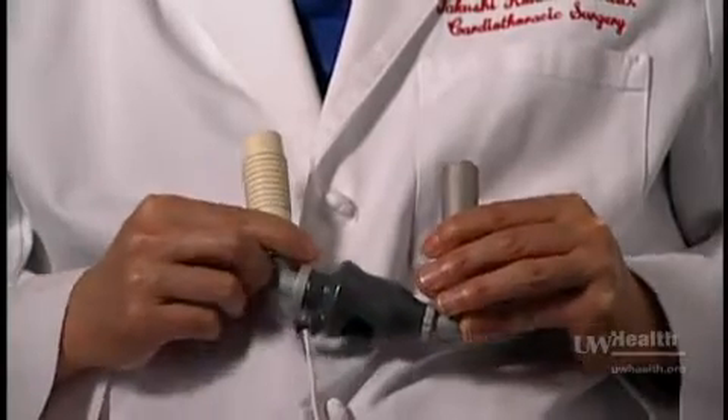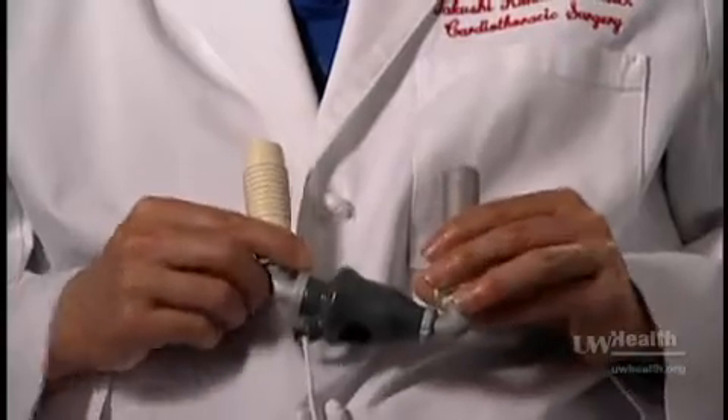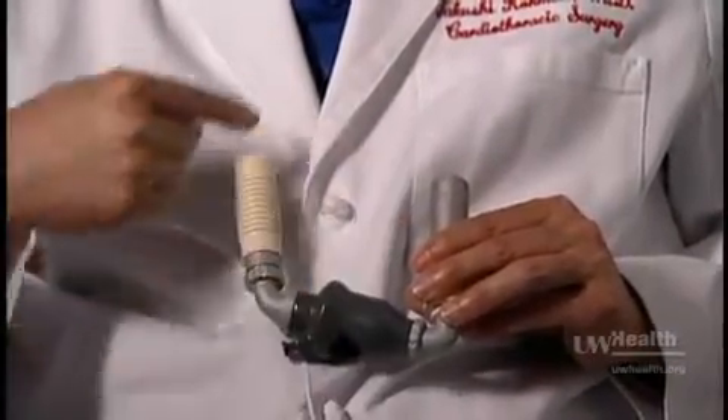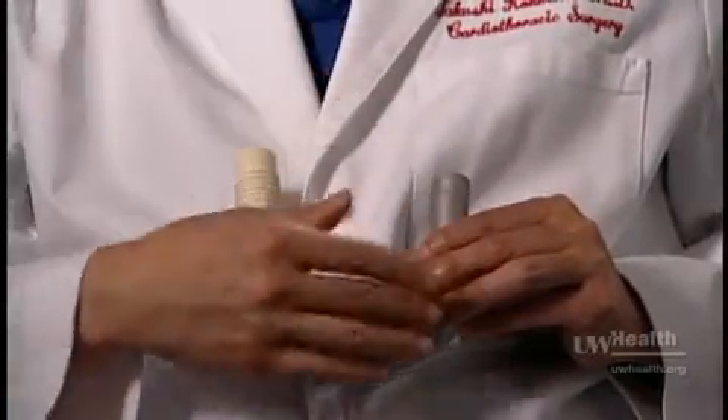So it is not a replacement — this is supporting or assisting the heart. That's why it is called a ventricular assist device, and it is not a total artificial heart or a replacement.